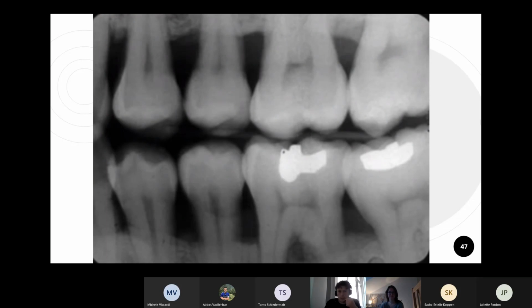All right, so now you would have to mention that it's a bite wing again, but also that it's on the left side this time. So you see the second and third quadrant. What's definitely to mention is that there's a lot of bone loss. You can see horizontal bone loss basically everywhere. And if you look at 3-6 and between the roots of the tooth, you can see some area of inflammation, some kind of cyst. There's some radiolucency going on there. So there's definitely some inflammation.